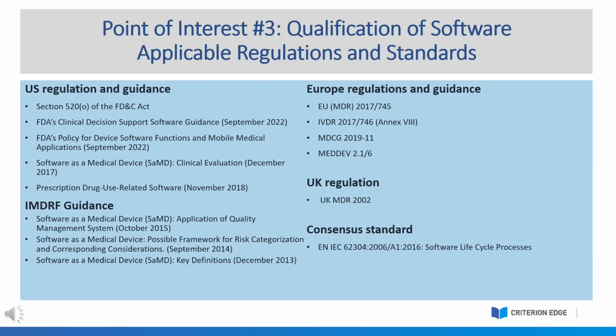For example, in the US, software for medical devices is regulated under the FD&C Act, whether it's for medical devices, in vitro devices, mobile apps, AI-enabled devices, and so on. Whereas Europe divides the software into medical devices and in vitro devices and regulates them under each separate regulation.